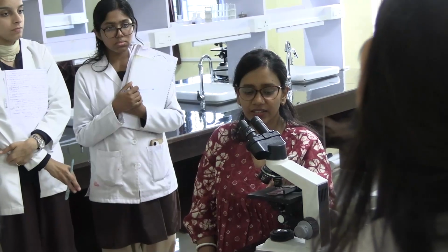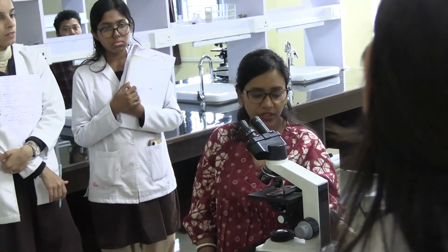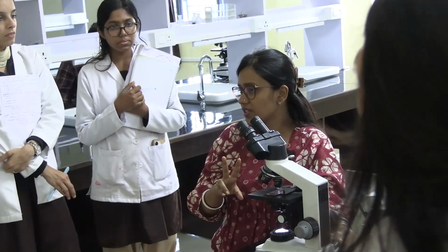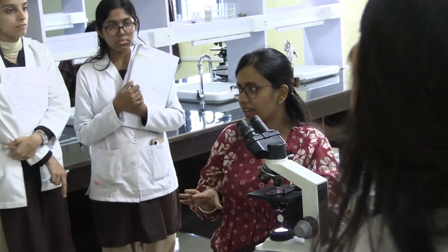So here in this slide, we have two foci, okay? It's very adjacent to each other. So at around 7 o'clock position, you can see the normal glands, two normal glands you will be seeing. And then at 6 o'clock position, you can see the invading glands, okay?